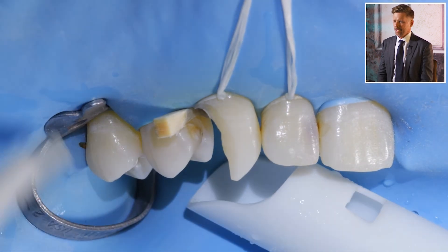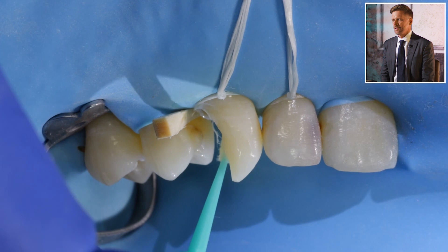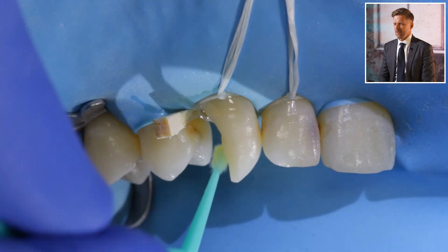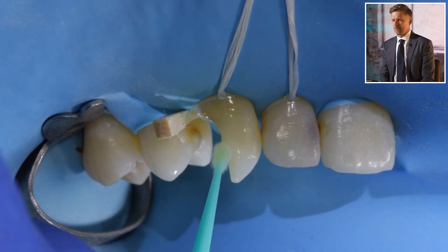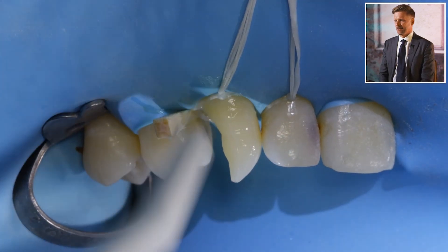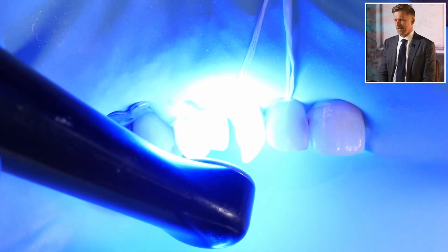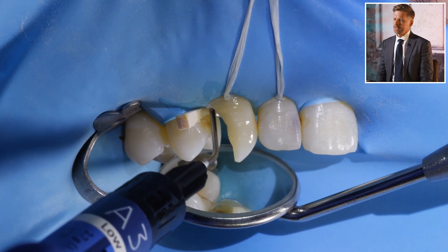We're drying off that edge — it's just for the enamel — to make sure we get no staining. Any contamination of the enamel is one of the main causes of stain. I'm using a self-etching primer and bond, specifically Essie Bond 2. We dry that off and then go in with the bond. I've used it for years — super good for getting low rates of post-op sensitivity. You don't want super thick layers of bond because that unfilled resin layer is prone to staining.